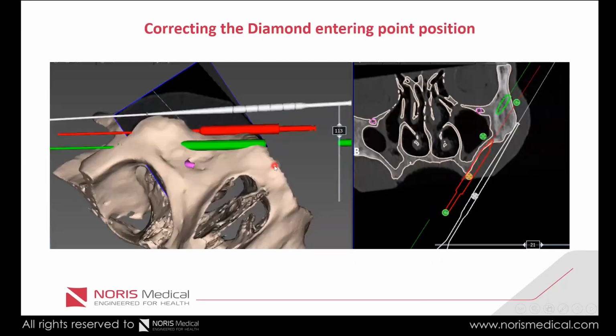That's the way. This is what we see. We take the diamond, we check the diamond, we see that when we are parallel in this position, we have the distance here and we have enough height of bone here. That means that if we drill now, we are going to be positioned correctly and not colliding with the implant, and we have enough bone above to drill. So actually we found the entering point for the posterior implant, like that.